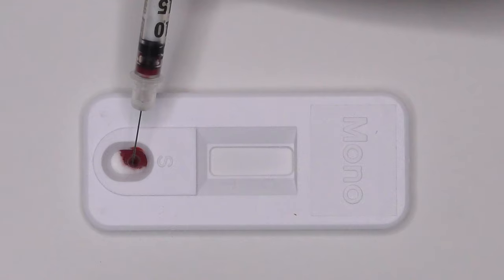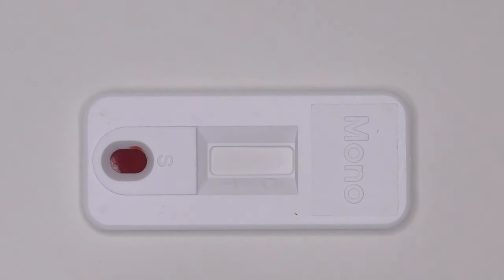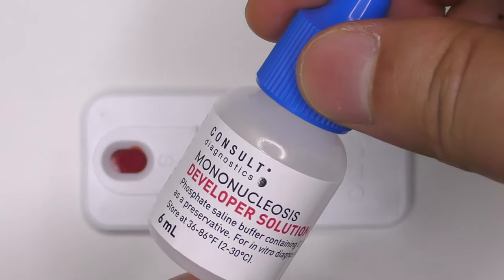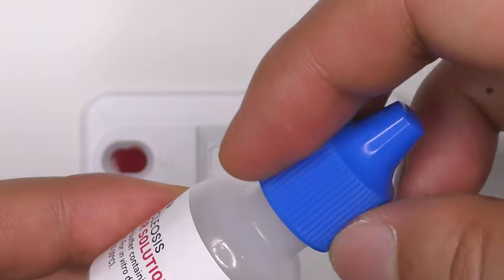Place two to three drops of blood into the cartridge's sample well. Two to three drops of developer solution containing a phosphate saline buffer is then added to the sample well.